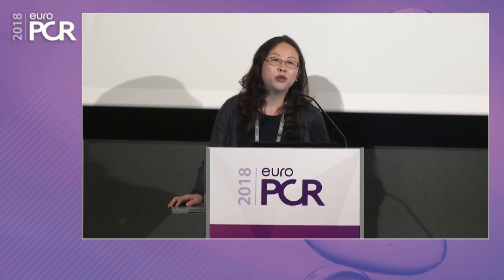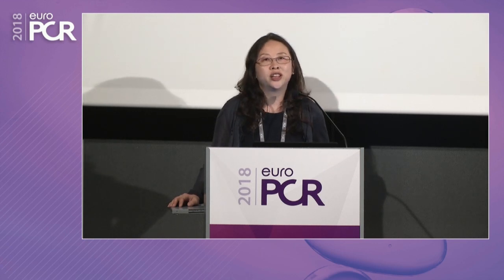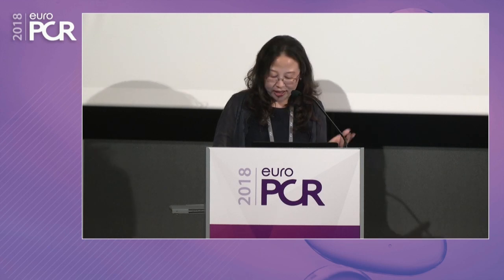I understand you, but the proximal LAD was not that big, almost just 4. Unfortunately in China so far we don't have a 5.0 stent, just 4 is the biggest. So that's why I chose Integrity. It can be expanded very well. I know from the bench test of Integrity, it can be expanded to 5.5 or 6. Yeah, I read the bench test. But maybe the integrity of the stent could be damaged. No, but from IVUS we didn't find any acute stent fracture. We have the evidence.